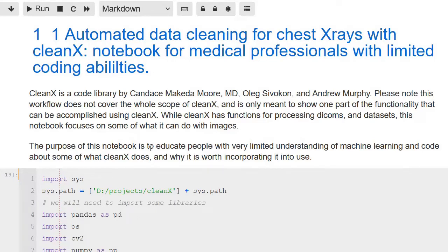In theory, AI could help these people, but in order to create functional, correct, and helpful AI, we have to feed the algorithms we create very good data sets. These data sets, if we're talking about creating an algorithm based on machine learning with chest x-rays, would have to have images that are proper and properly labeled. So we have a bit of a problem.